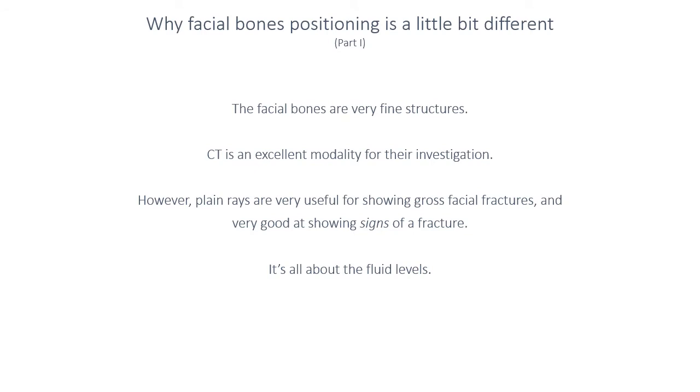When first learning positioning of the facial bones, it's important to understand a couple of background concepts. The first of which being that the facial bones are very fine structures. There are particular structures of the facial bones which are very, very thin, quite difficult to see, and when they do fracture, some of the fracture structures are quite fine. As a result of this and the fact that the facial bones often have superimposition of adjacent structures, CT is an excellent modality for being able to investigate facial bones injuries.